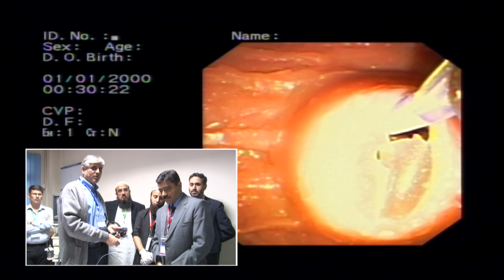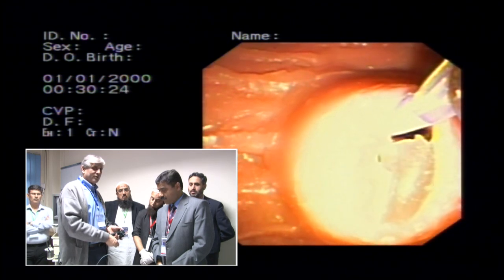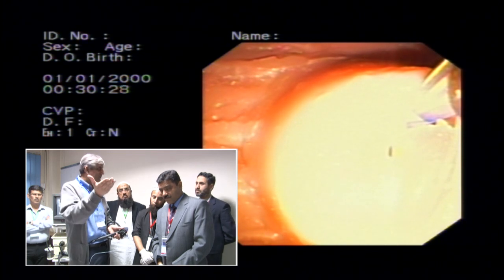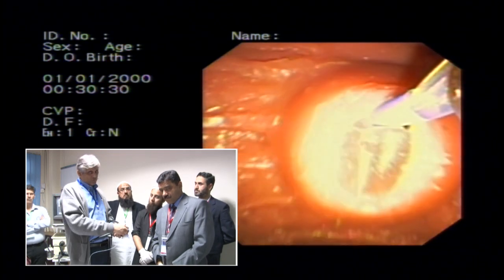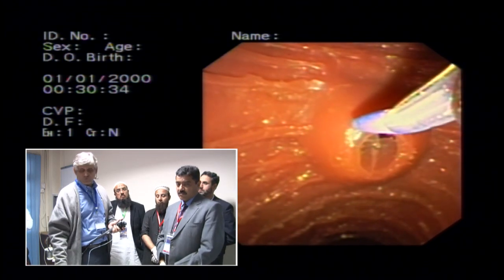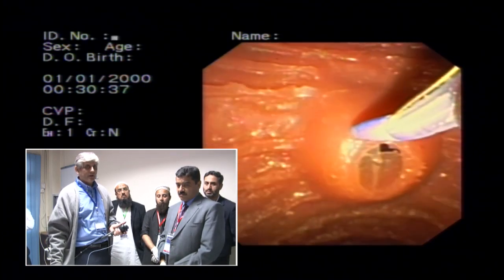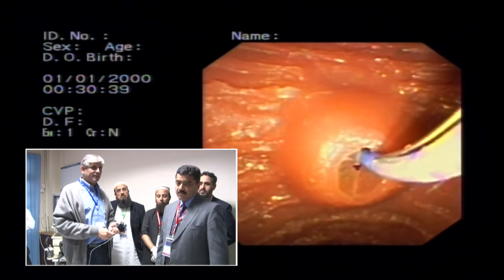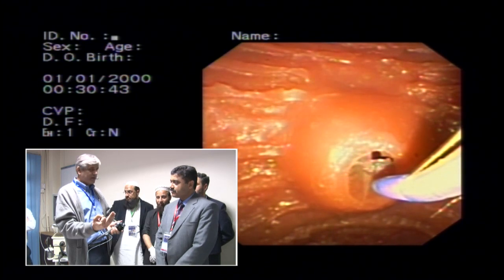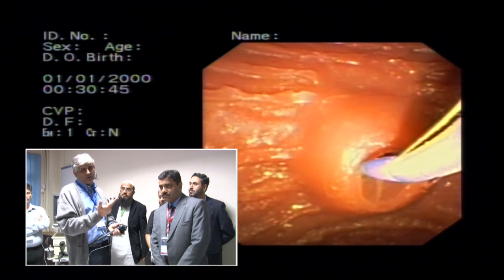You just go up. I lift it with my big wheel now, trying to lift up. You can also do a pre-cut papillotome. Now that you've come into difficulty, you can also use a bow. Sometimes you use a bow like they showed. Then you have different techniques. In difficult cases you can use wire, you can use bow. Right and left you have already used.